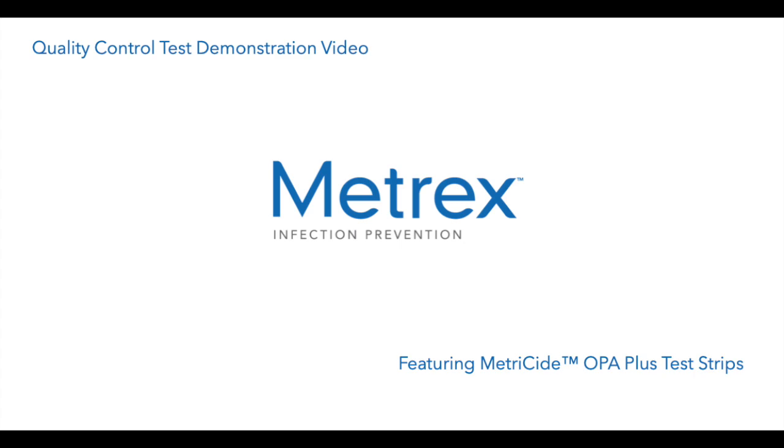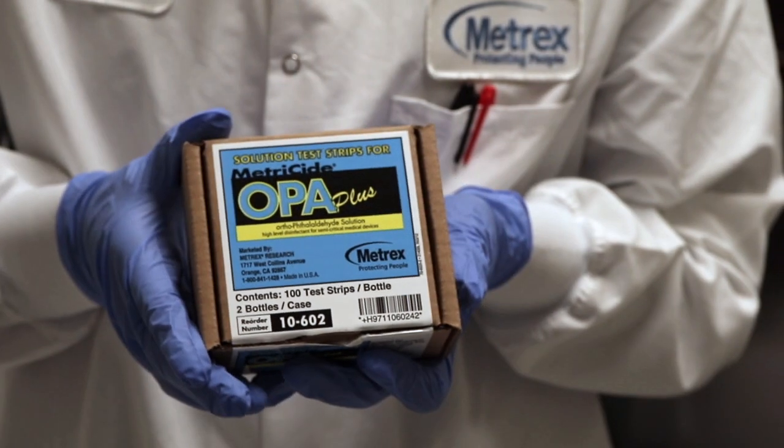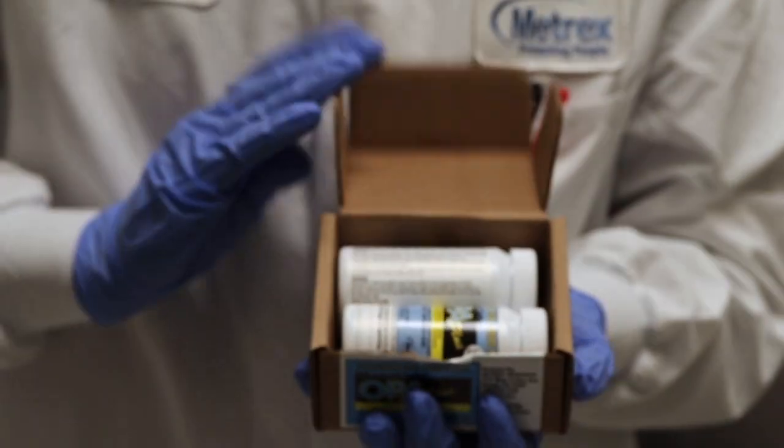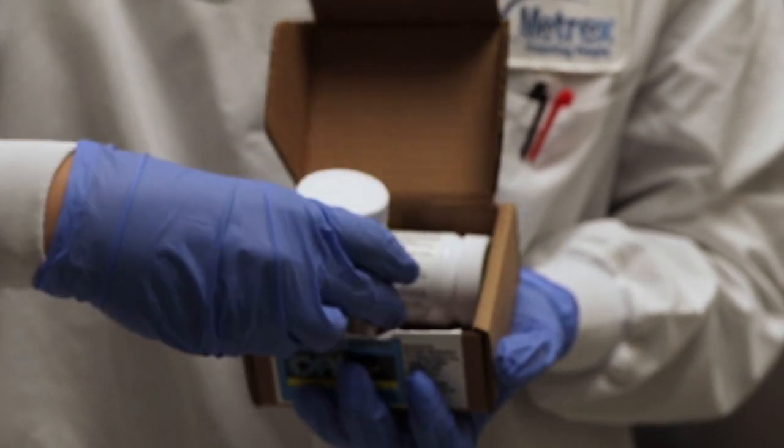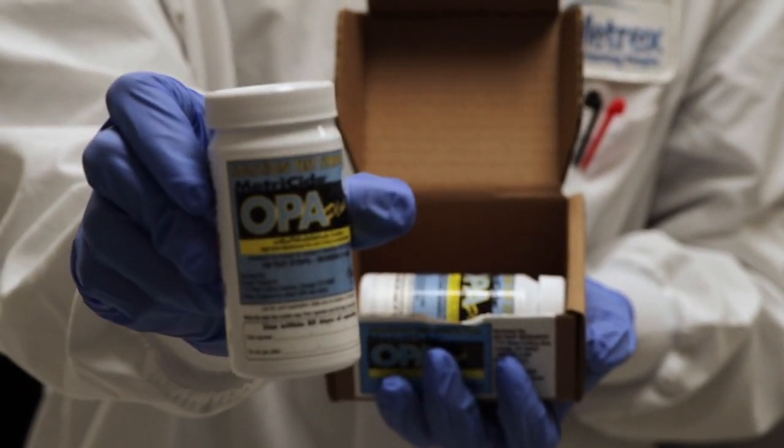Hello. This video properly demonstrates how to perform the quality control test when opening a new bottle of Metricide OPA Plus test strips. Before the test is performed, ensure you are wearing proper personal protective equipment.